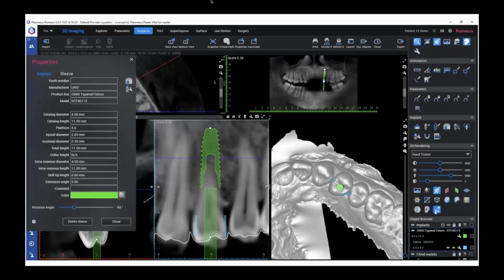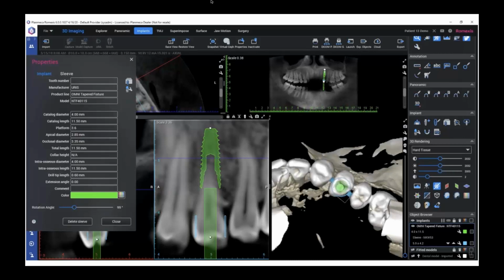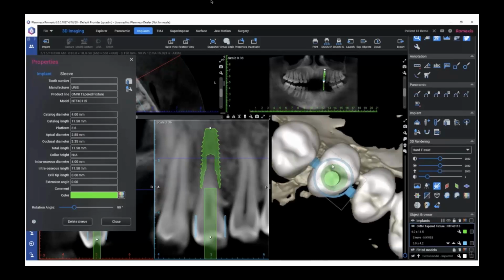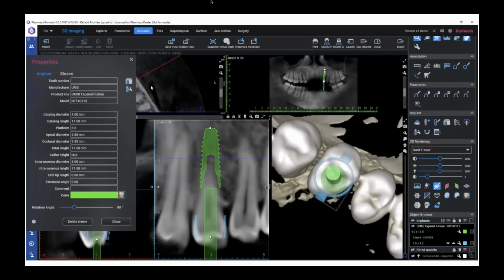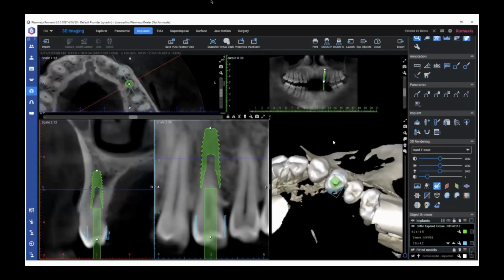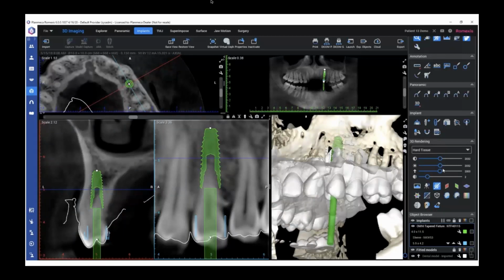So when I'm doing immediate implants, if I have the luxury of planning ahead, it's very easy. I've even done some cases where a patient has come in symptomatic, and I'll plan the case as long as they're willing to wait a little while. I'll plan the case, get them numb, and quickly 3D print a surgical guide, especially for a high stakes anterior case where I'm concerned about implant position, where placing an immediate may be difficult. So it's definitely possible to do that.